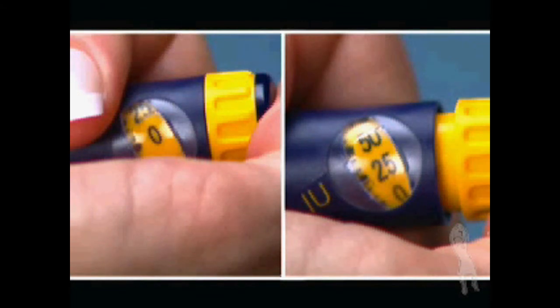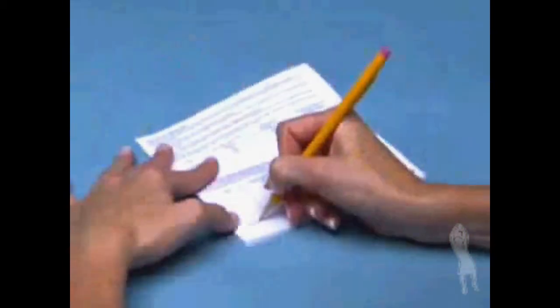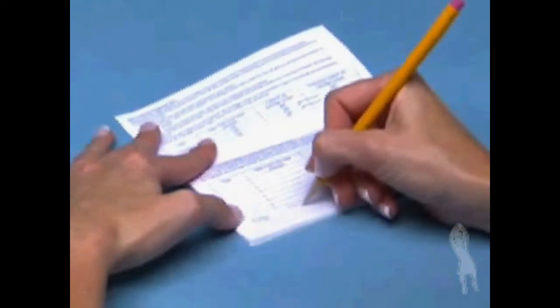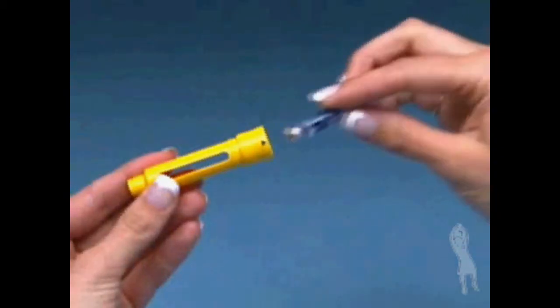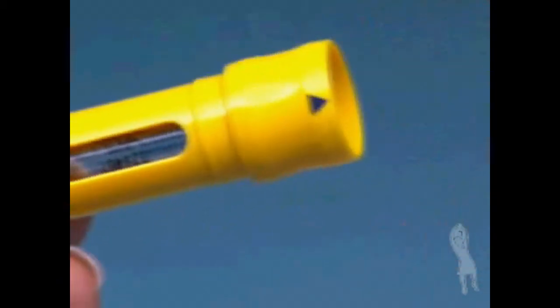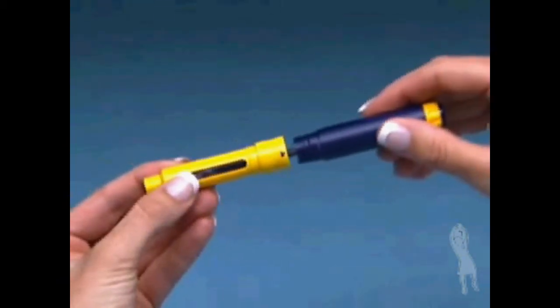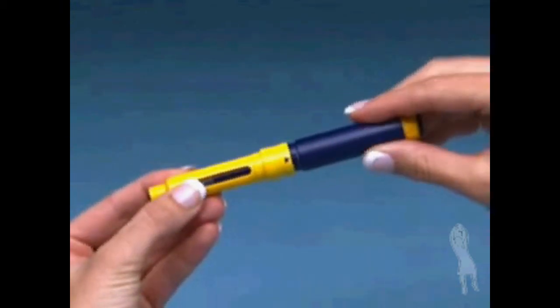The number in the dosage window will give you the amount of medication needed to complete your dose. Write this number down. This will be the number of units you will need for the completion of your dose. Start over with a new Follistim AQ cartridge and a new needle and follow all the instructions up to this step. Make sure you choose a different injection site to complete your dose.